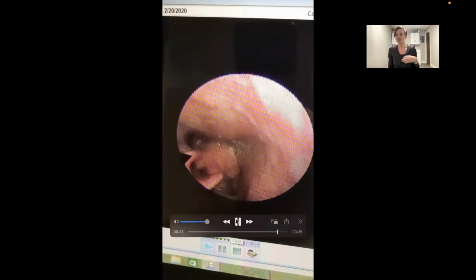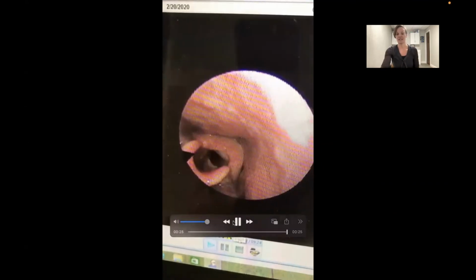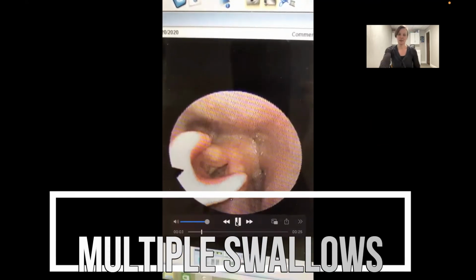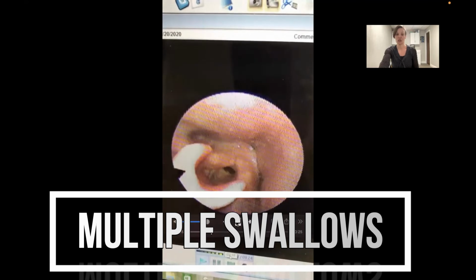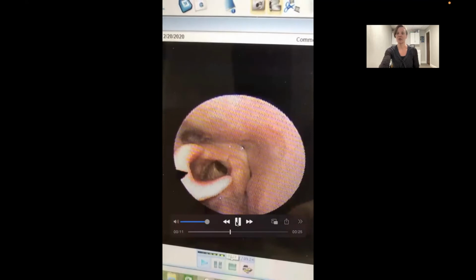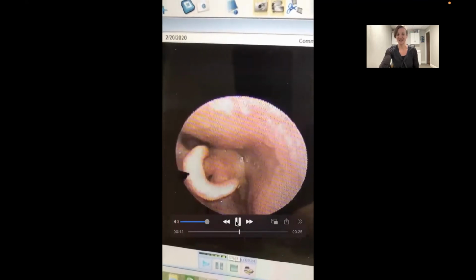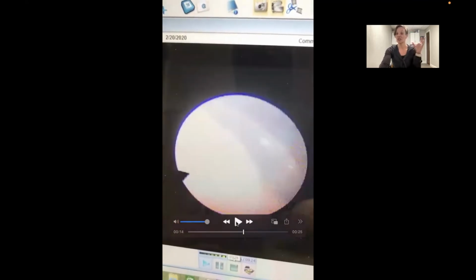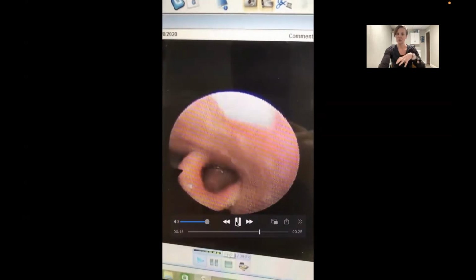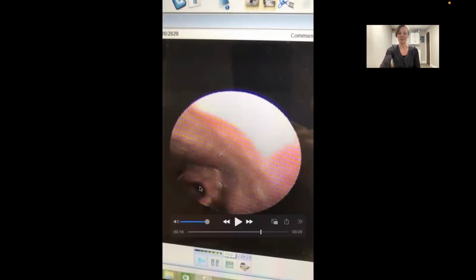Again, as the patient's going to swallow, I want you to watch a couple of things. First, they complete what we would call multiple swallows, which is 2 swallows in the speech pathology world. I'm not too concerned about that, okay? The reason they're having to do that is because they're having to push the liquid down through the pharynx again, right? So as this patient goes to swallow, we're getting that shortened whiteout period for our FEES. And in that whiteout period, we get a second little swallow there. And then we're trying to sneak a peek into our vocal cord region.